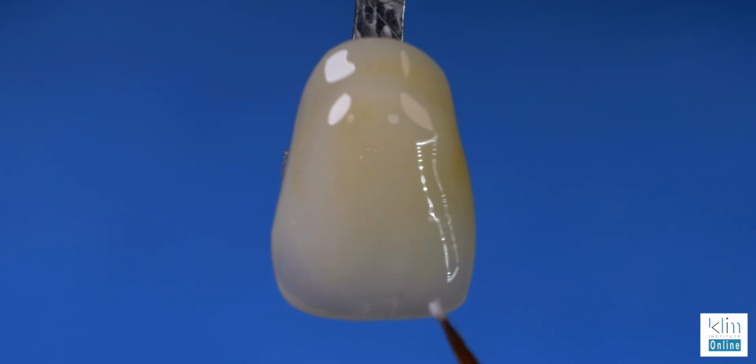In many cases, when I'm working through this exercise, I have a photograph or I'm looking at the patient, building in those harmonious characteristics to really make it melt and blend in the mouth. And this is the beauty of MiYO. We're layering the liquid on top of each other where it holds its form and shape and color distribution.